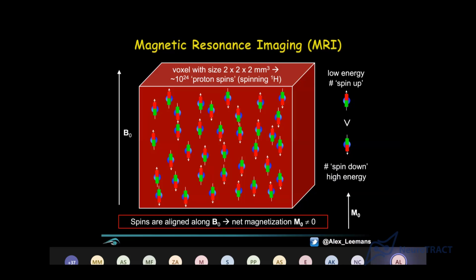When I'm explaining it like this, I know it's kind of a simplified version, and people are then typically afraid, like, oh my God, I'm getting radiation. But as far as we know, it's completely safe. Nothing to worry about, right? It's the same principle in a way like a microwave, where you have resonance of your molecules, but you're not getting cooked unless it's a really, really big magnet and high frequency components.